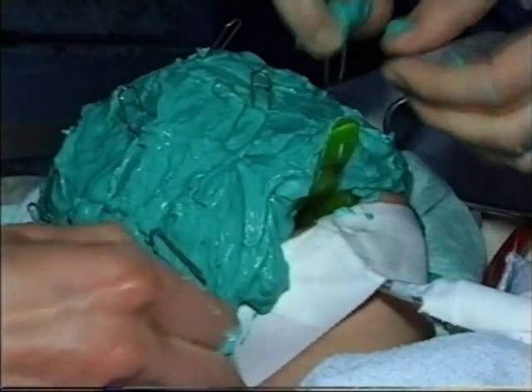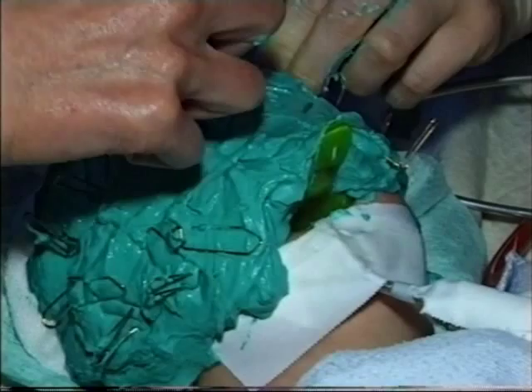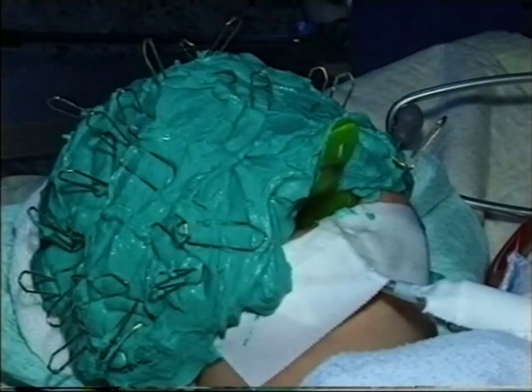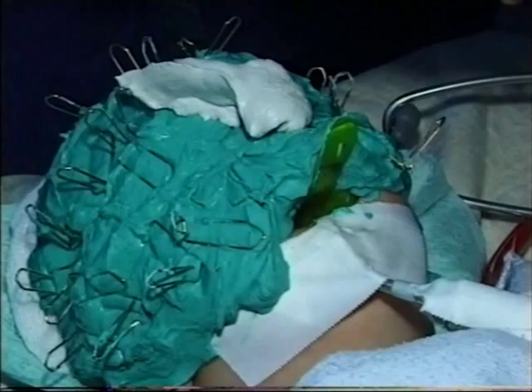I'm going to show you the clip pins inserted into the impression material in order to retain the plaster that we are going to cover the impression with. The purpose of the plaster is to support the impression material during removal. It acts as a tray.